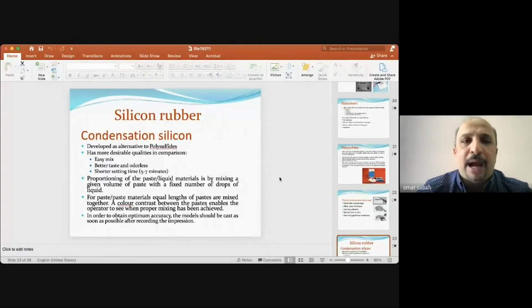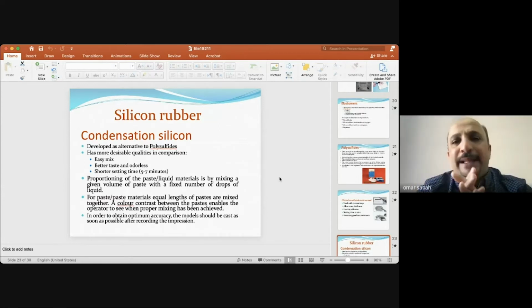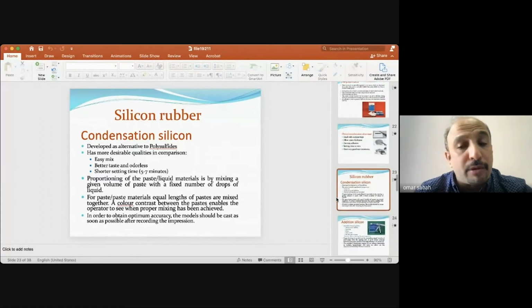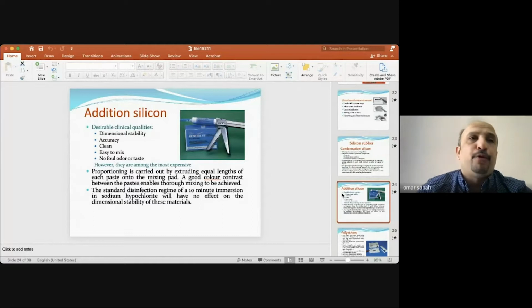And I give you one note: if you have time, directly pour any material that you use, regardless of the properties of these materials, because a difference in dimension, even half or 20 or more, for example a part of a millimeter, affects the retention of these dentures. Take care about these things, because dimensional change is important and will destroy your work, okay? Finally, you can lose your job by a simple mistake like the time for pouring of these materials.